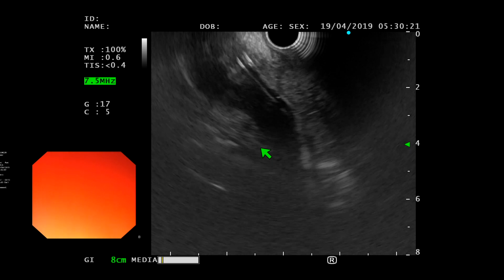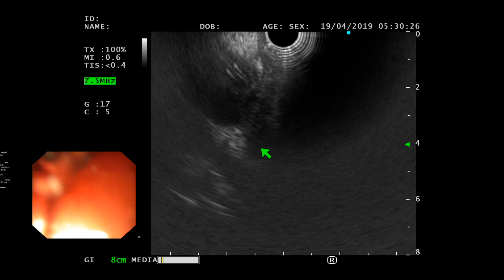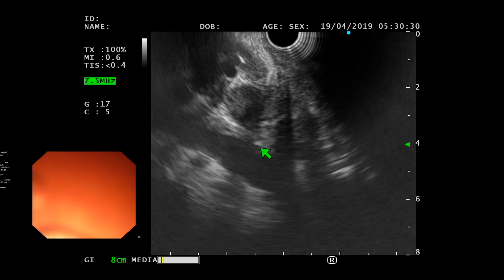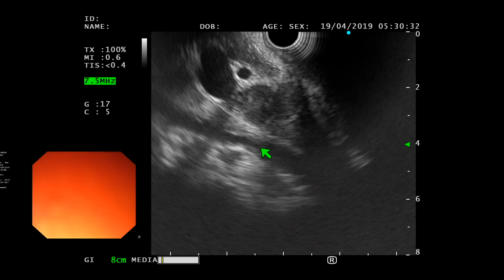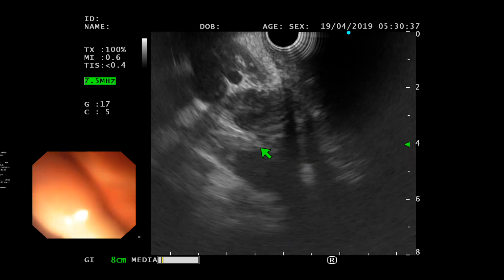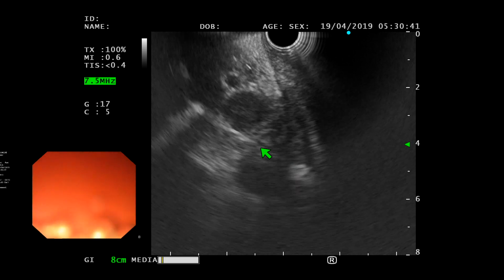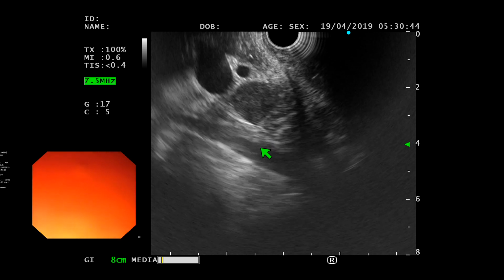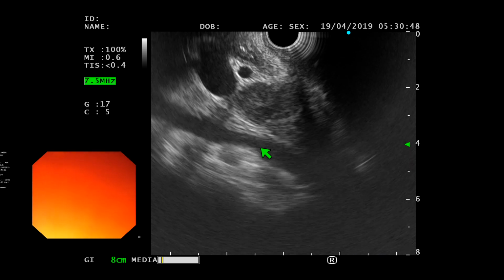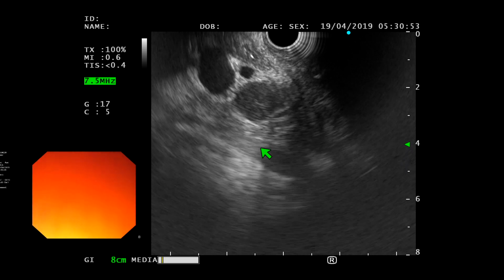So actually, putting elastography helps me. If I report that I have done the biopsy, but on elastography it was all green, and I couldn't really see much more to it, then when it goes back to MDT, it helps them decide that if the biopsy is also negative and the elastography impression is also benign, we can keep this patient under follow-up and repeat the CT in 2 months rather than going mad about repeating another FNB, doing another EUS, or trying to do spyglass to see if we can see any pancreas. Are you with me?